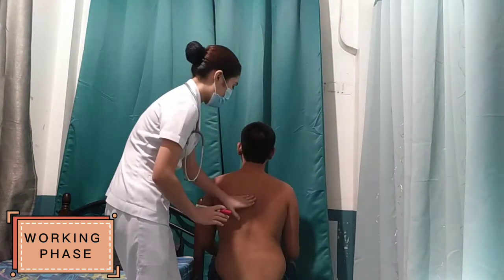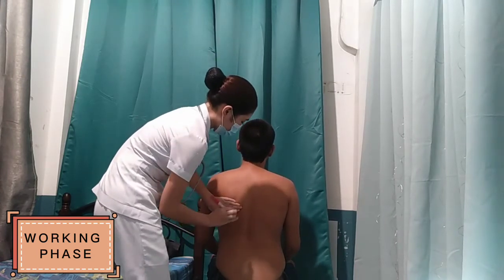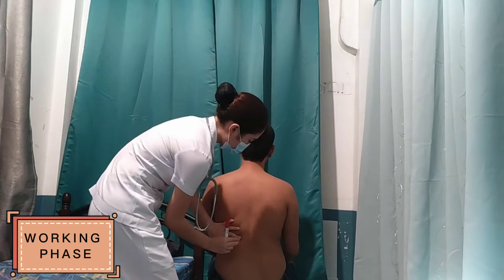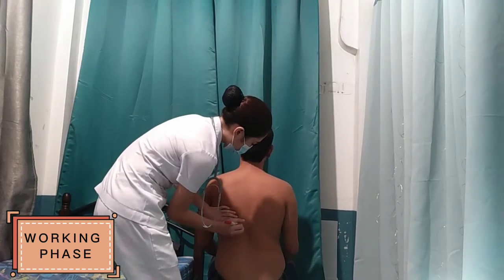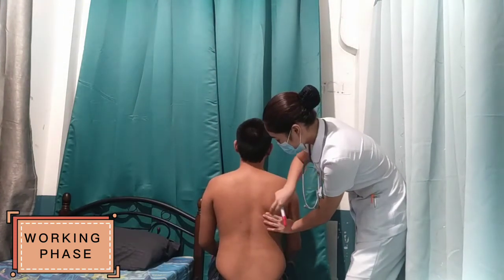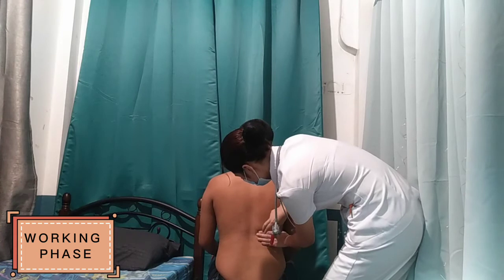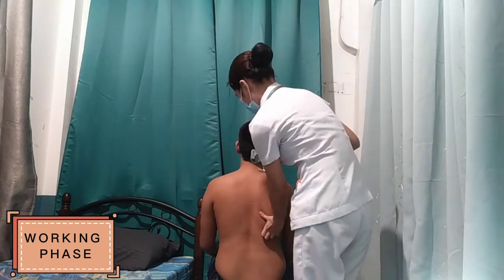Right, sir? So can you inhale for me, sir, and then hold it? Alright. Okay, so inhale for me, sir. And exhale, sir. Alright, inhale again, sir. Exhale. Alright, sir. Other side, inhale for me, sir. Exhale. Inhale again, sir. Exhale. Alright, sir.